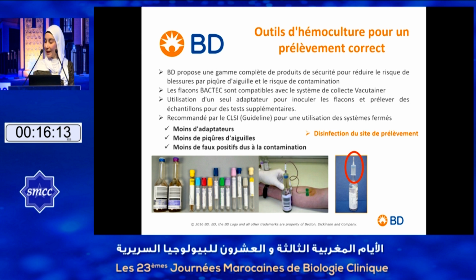Pour la manière dont on prélève le sang pour l'hémoculture, il est préconisé d'utiliser un système fermé, une sorte d'adaptateur pour inoculer un flacon d'hémoculture et par la suite faire le prélèvement sur les autres tubes pour des analyses supplémentaires comme la biochimie ou autre. Pour cela, on a des adaptateurs à usage unique, adaptables sur les flacons d'hémoculture. C'est pour réduire les contaminations et réduire les piqûres d'aiguilles.